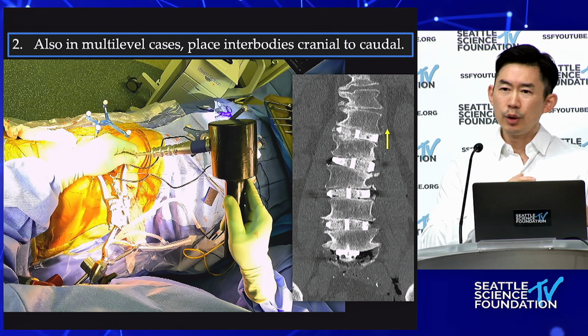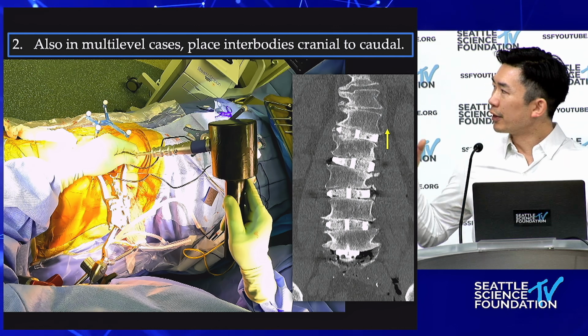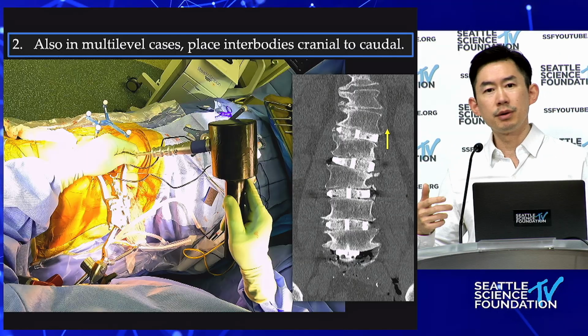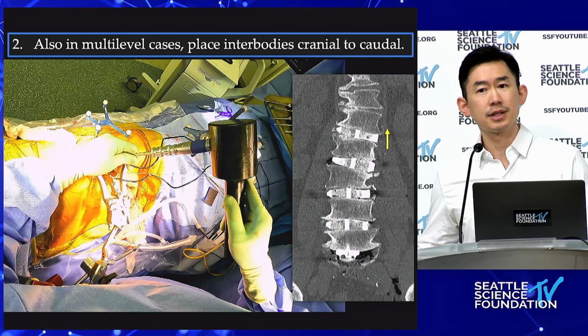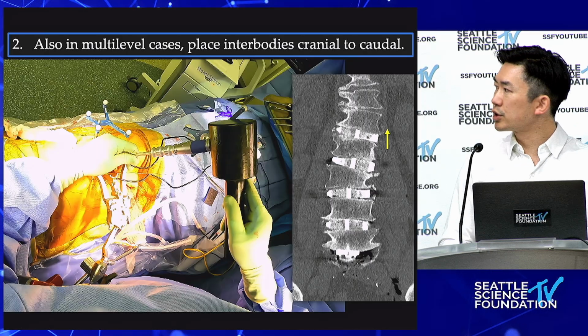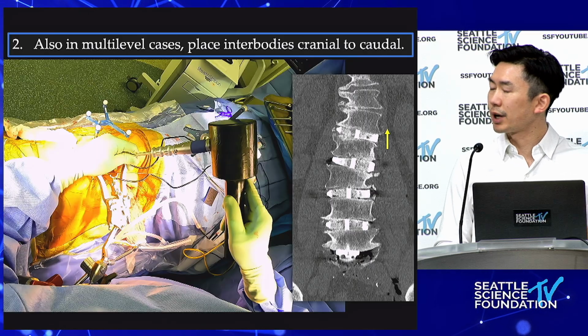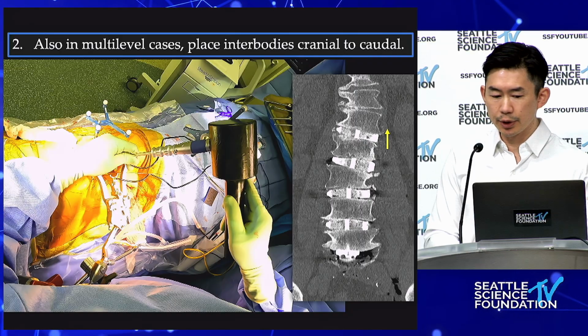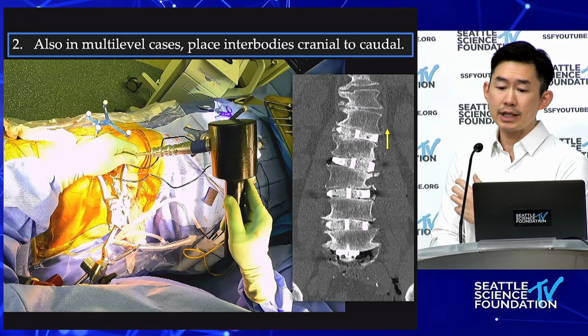Because if you think about it, when you work from the top down, the rest of the spine is attached to disc space, facets, sometimes you're bone on bone, attached to the sacrum, attached to the pelvis. There's no way you're going to move that south. So the spine is always going to be more easily moved up, naturally against thoracolumbar junction and the rest of the chest. So always start from cranial to caudal, and you can navigate all the way down.